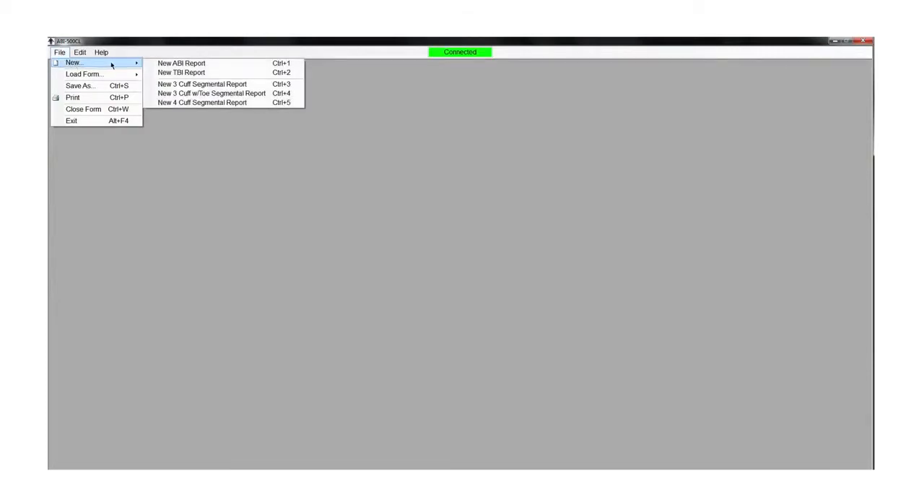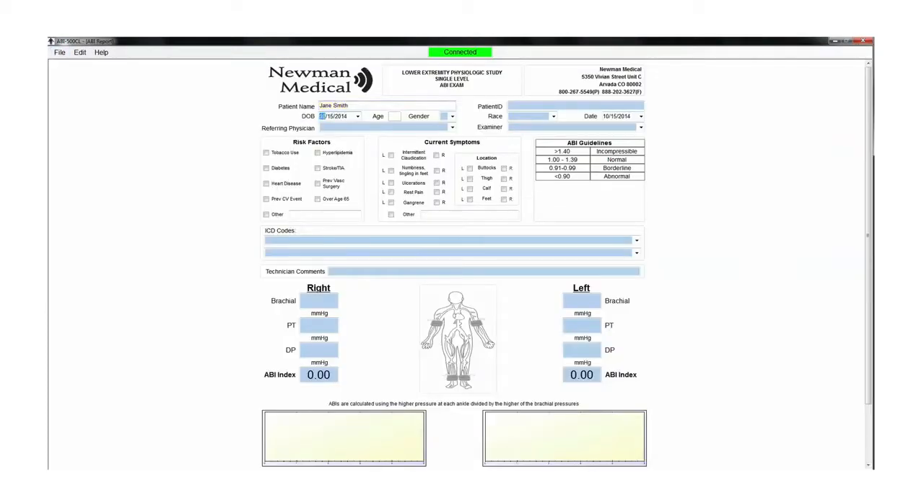When the screen opens, click on the File tab, then New, and select ABI Report. Take the relevant patient history, including patient information, risk factors, current symptoms, ICD codes, etc.